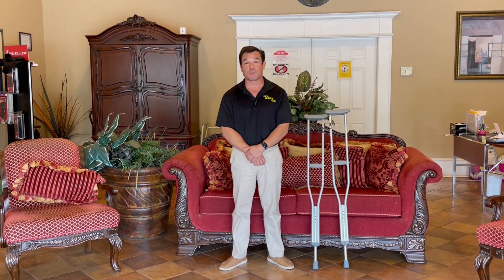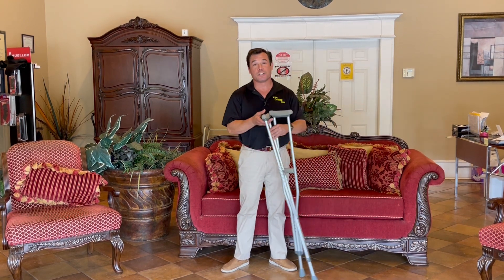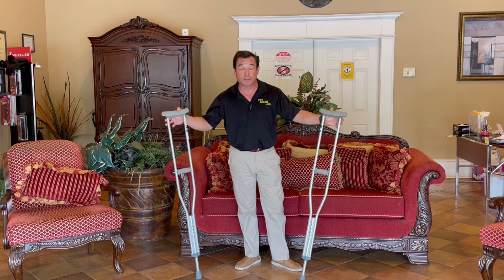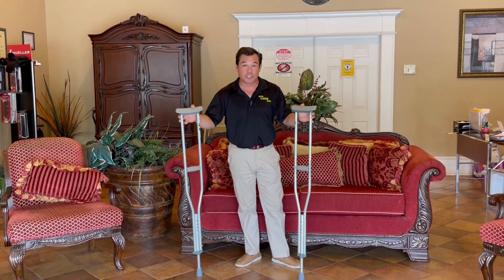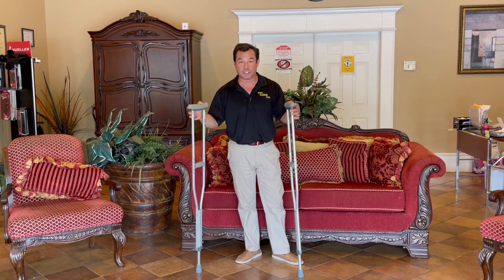Today, as you've seen in the past, we are going to discuss another piece of equipment. This particular piece of equipment is the crutch. These are probably the most used piece of medical equipment that you see out there on the streets. It is also, oddly enough, one of the most misused pieces of equipment that you can see.